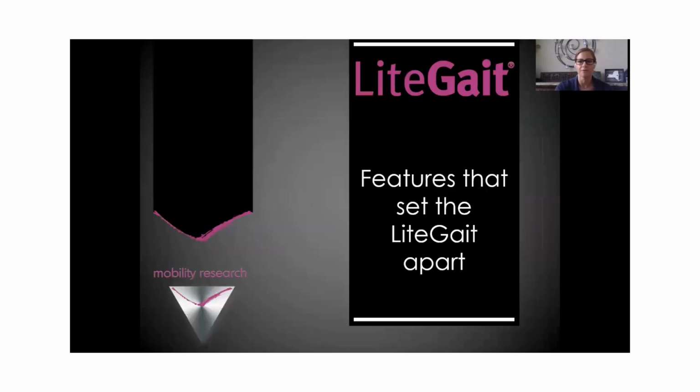I want to talk to you about some of the features that set the LiteGait apart, but I want to remind you back to that Goldilocks slide where we talked about this just right amount of challenge with our tasks. The LiteGait was originally developed to be very rigid support. Some features and functions have been added to increase the available degrees of freedom of movement for the client. But really, the benefit of the LiteGait is that we have this full spectrum.